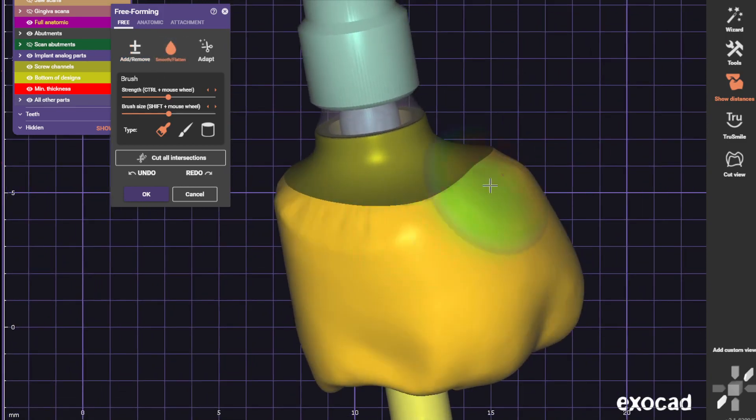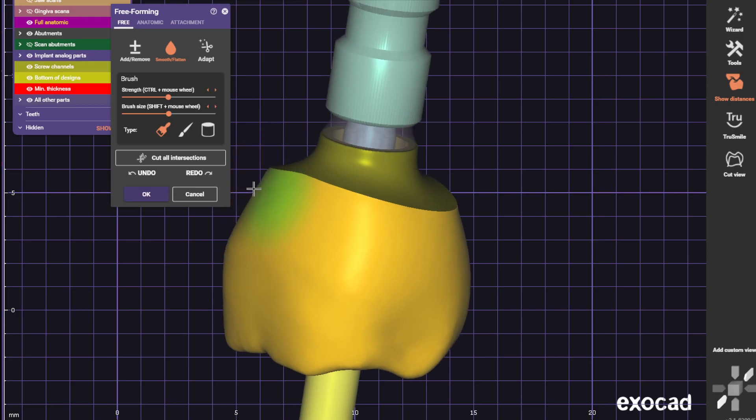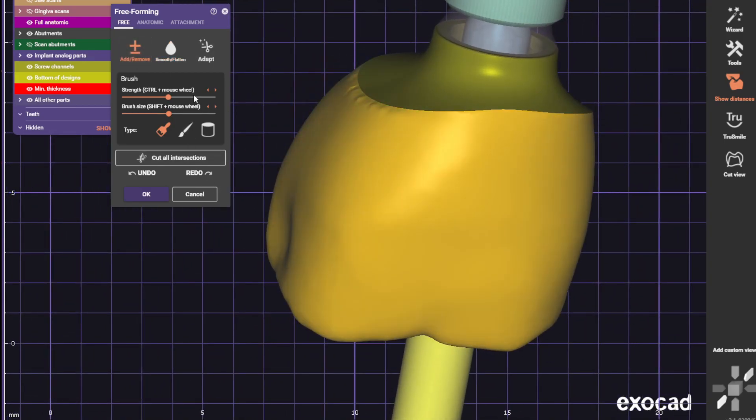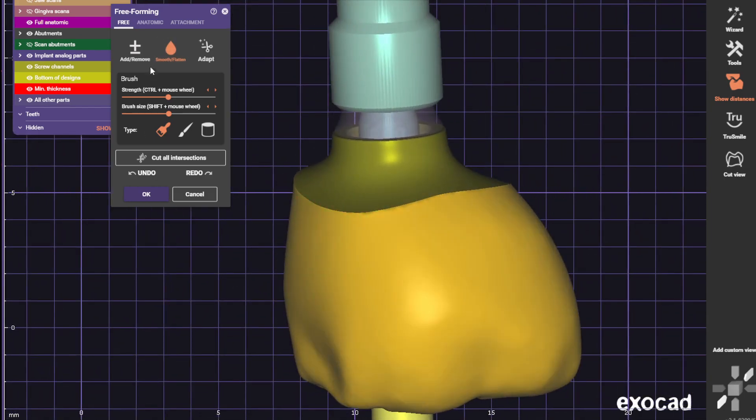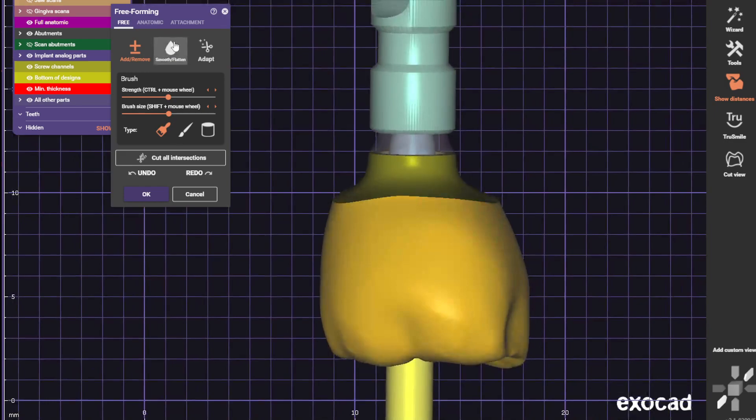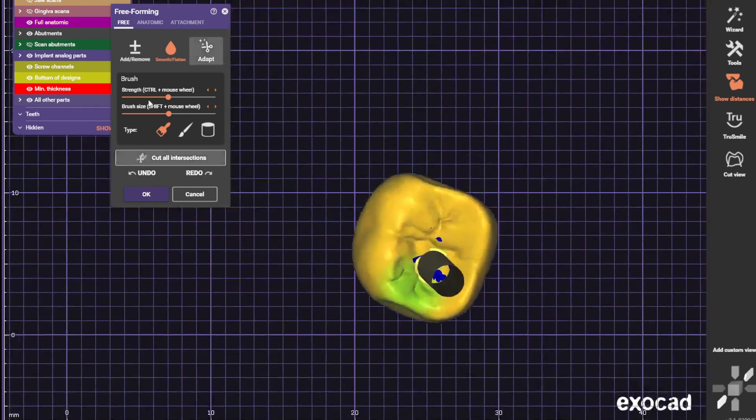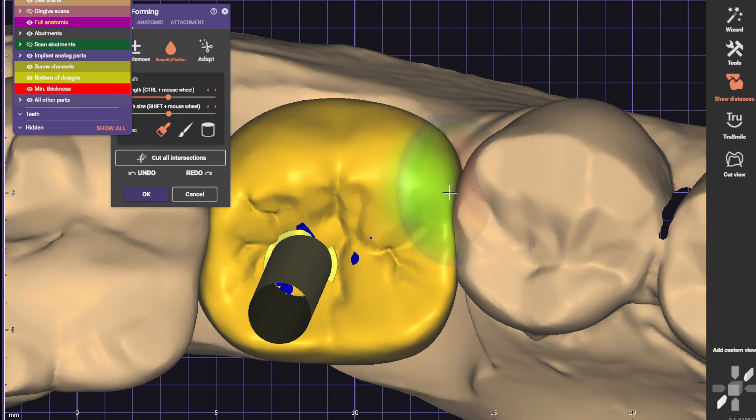Let me just smooth up around the margin here where we cut away. I always like to add first and then smooth. I hold down the shift hotkey a lot when I do the smoothing—makes it move faster.